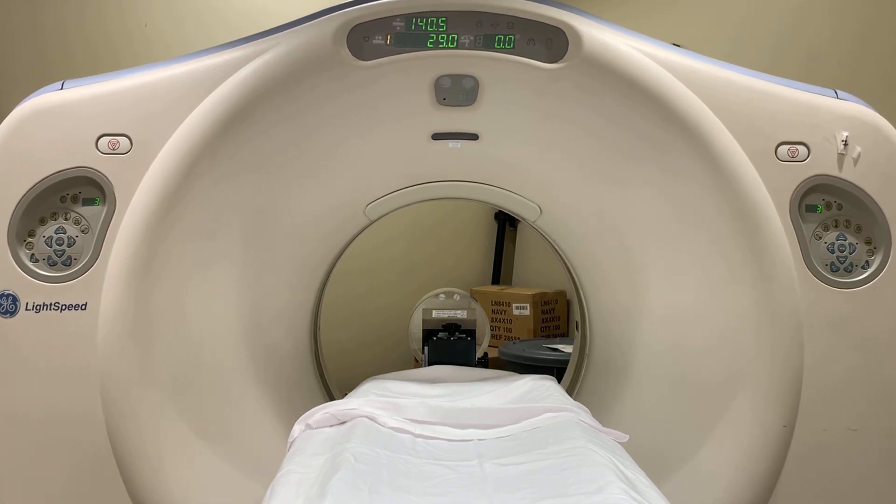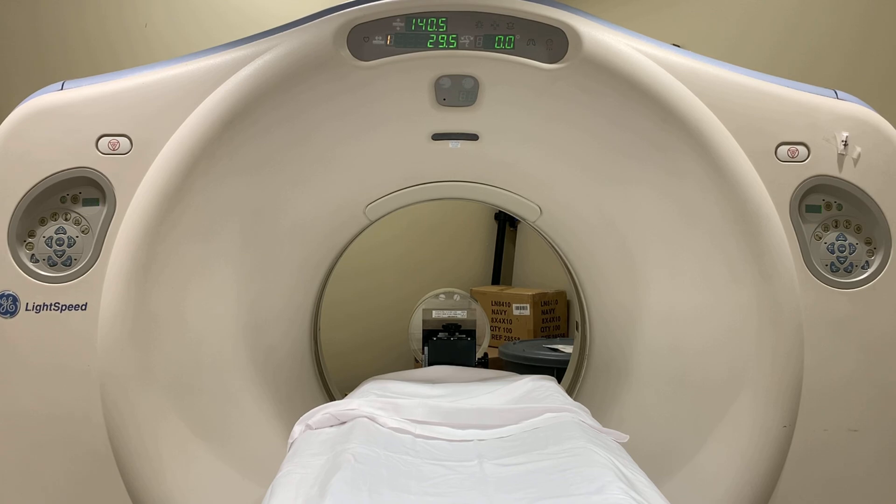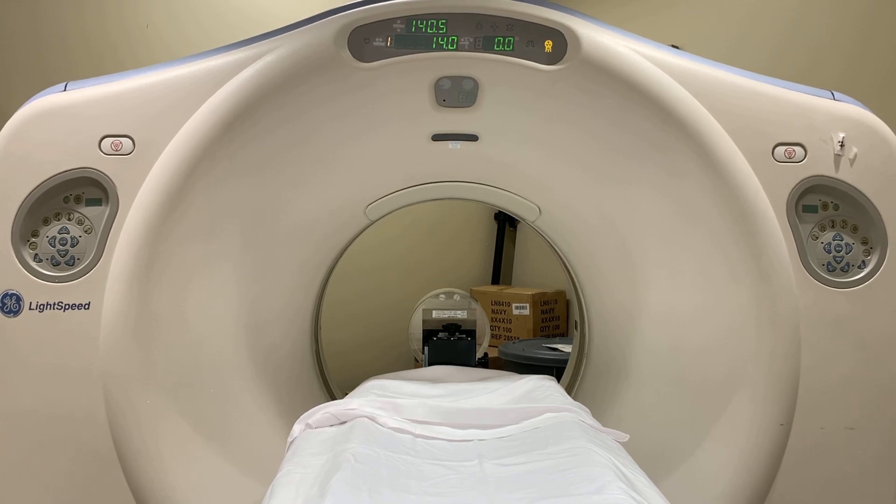During x-ray exposure, the x-ray on LED will illuminate on the top right corner of the CT screen.